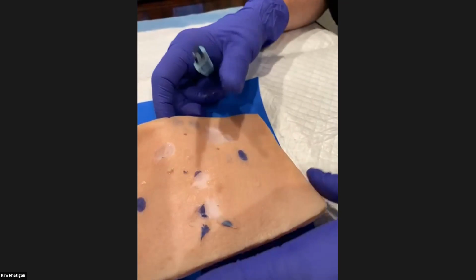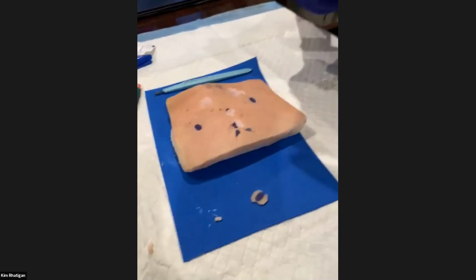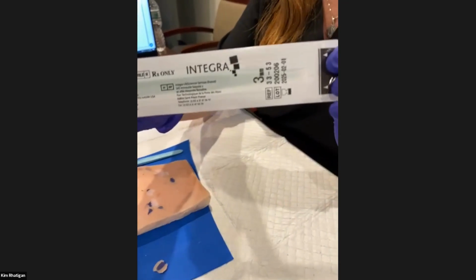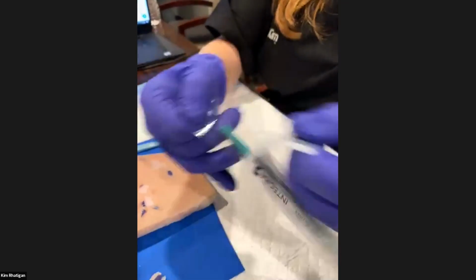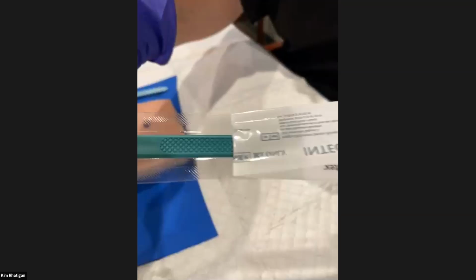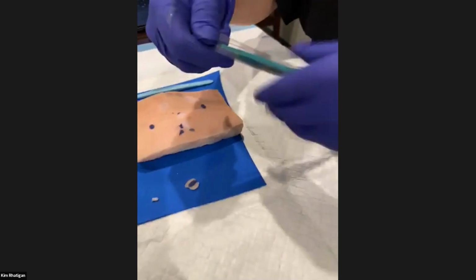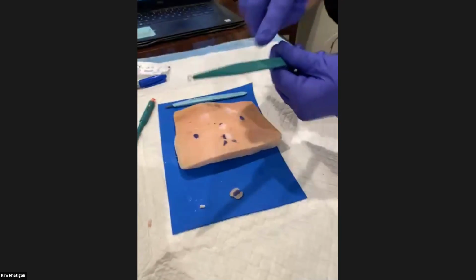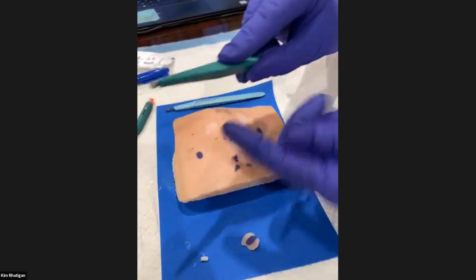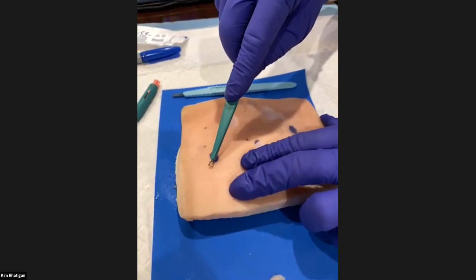All right, do you want me to move on to the curette, my favorite tool of all? Now, in this particular manufacturer, when you open it up, the crosshatched side or dull side will be up towards you. Let's see the crosshatch. So the sharp side is down in the package. If you recall, he said keep the crosshatch on top because the bottom is sharp. So wherever the crosshatch is, I'm going to put my finger and do a nice little shave.